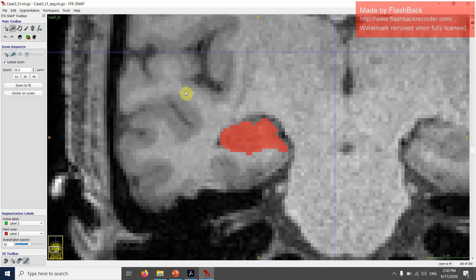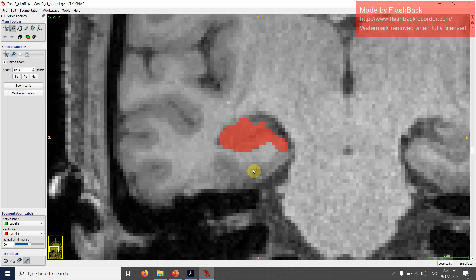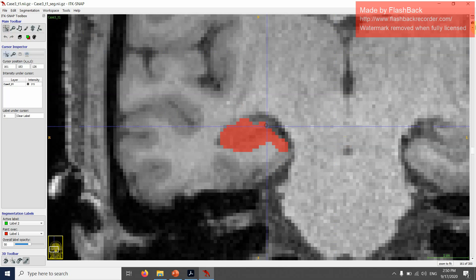This would be, in my opinion, the last slice of the anterior hippocampus, and this would be the first slice of the posterior hippocampus.